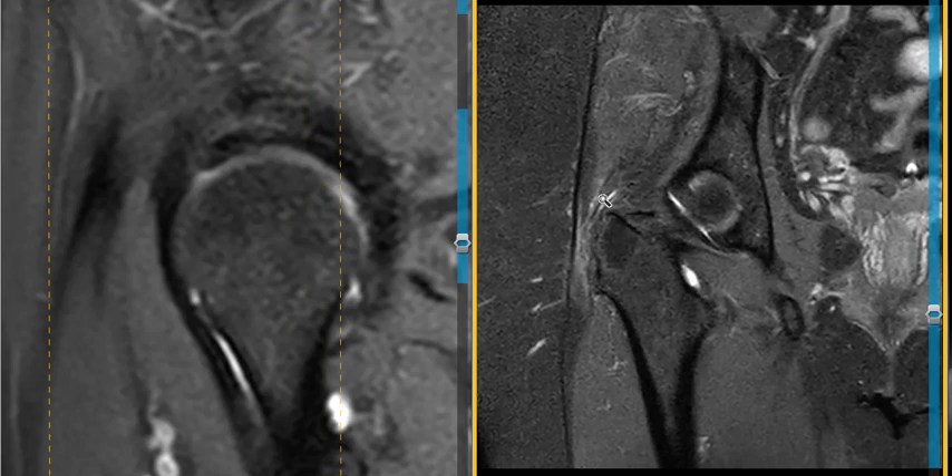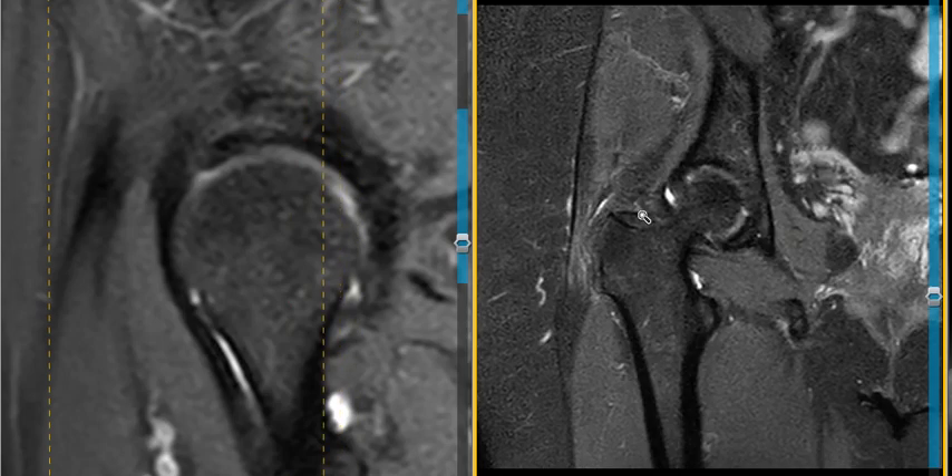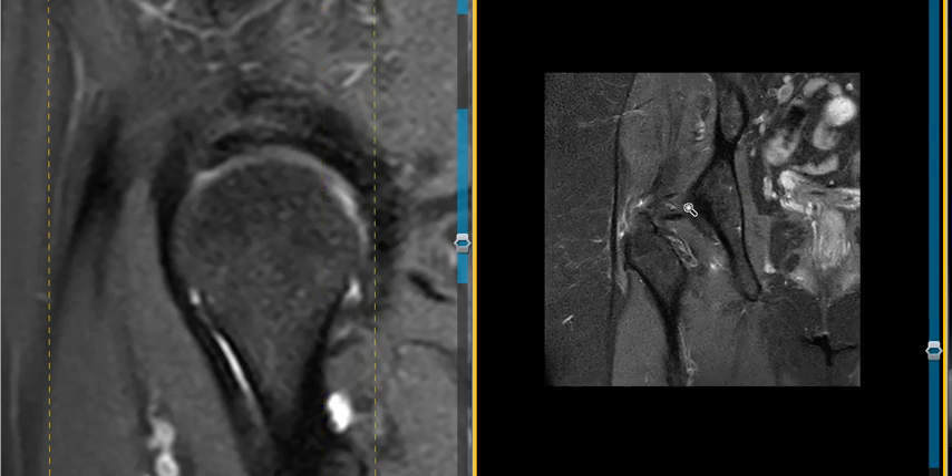So this patient has a tear in the right hip labrum contributing to their pain, and a chronic inflammatory process likely related to psoriatic arthritis that may also be contributing to their symptoms. Thank you very much.